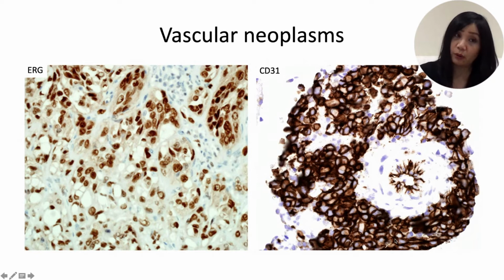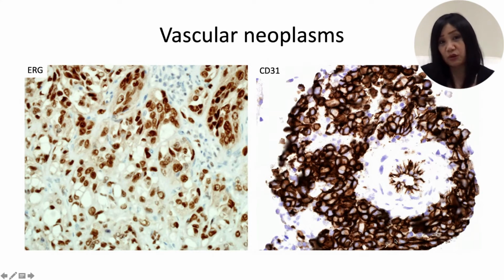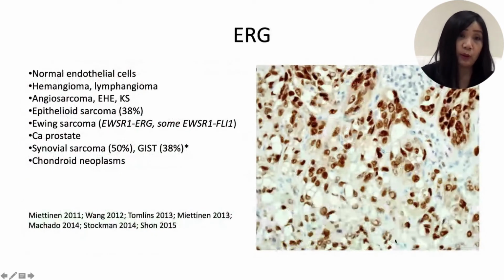We should not overcall a histiocytic inflammatory population scattered within the cells that show more moderate rather than strong, less specific, often granular cytoplasmic expression as true expression. So CD31 should be, in vascular markers, diffuse and strong like this, and we should not overcall CD31 showing weaker staining to moderate staining in a histiocytic population.